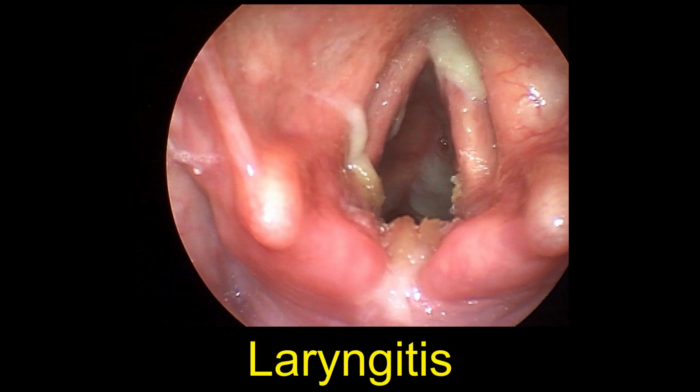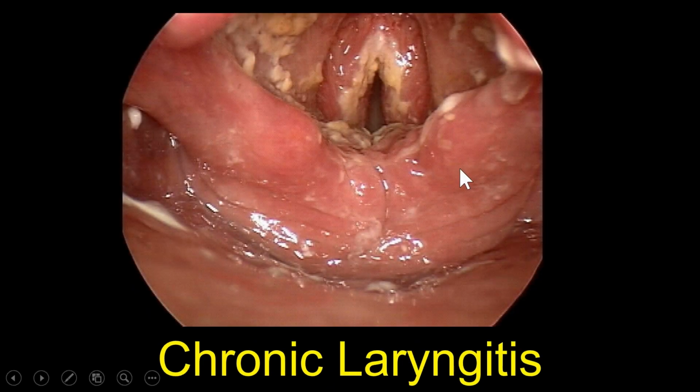That's laryngitis. So that's what it looks like on endoscopic examination, looking down at the larynx with all the swelling, some redness of the airway, some edematous changes, and that overlying infection. So that's what laryngitis or supraglottitis looks like on endoscopic exam. Now, if that's diffuse and more edematous, you see here all the thickened changes to the aryepiglottic folds. You see the false cords, the true cords, and you see all this white plaque like an overlying Candida infection of a chronic laryngitis, where we have more edematous changes and thick, boggy changes to all of those structures.